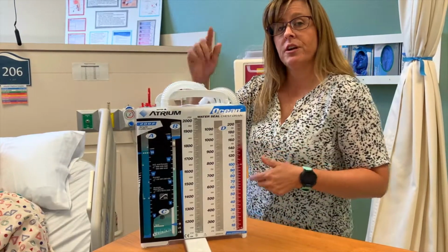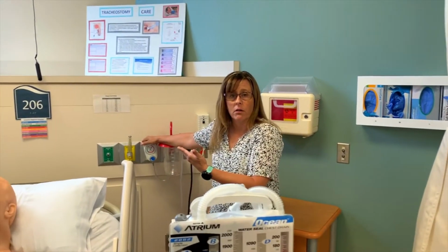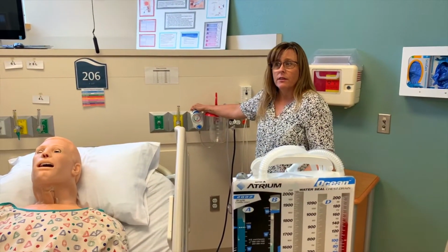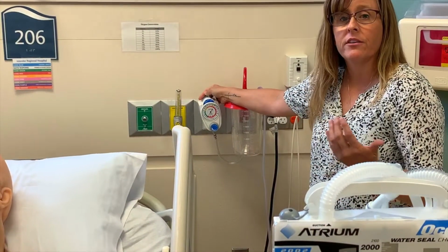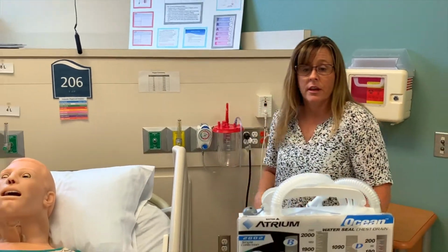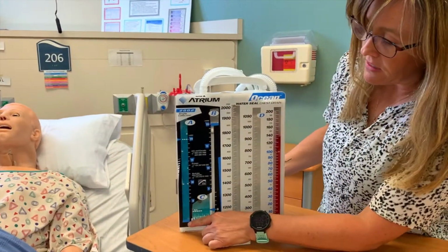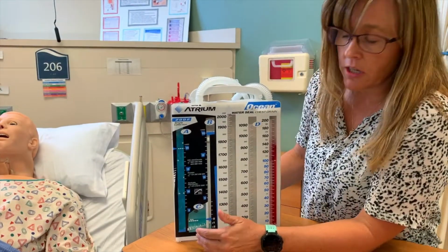So what we're gonna do is you got to have this connected to your wall suction. Your wall suction is usually here on the wall, all right? It's got two different things that we can use. You can either use an intermittent suction or a continuous suction. You need to put it on continuous suction. So you'll click the side that allows it to go on to continuous suction. Now, what that does after I turn that on, it will then make that suction control chamber bubble, all right? The bubbling is good in this chamber, all right?